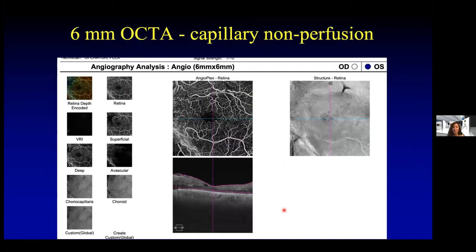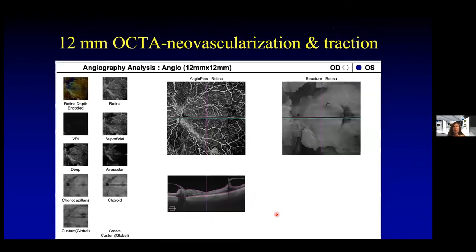This is the same eye looking at the six millimeter scan. We can still see changes in the fovea, but now there's some irregular blurring of the vessels, and on the en face OCT we can see striae from traction. Here's the 12 by 12 millimeter OCTA, and here we can identify abnormal retinal blood vessels with some capillary nonperfusion and what looks like traction — evident on the en face where those regions look dark because they're more elevated — and the structural OCT below confirms that there indeed is traction.